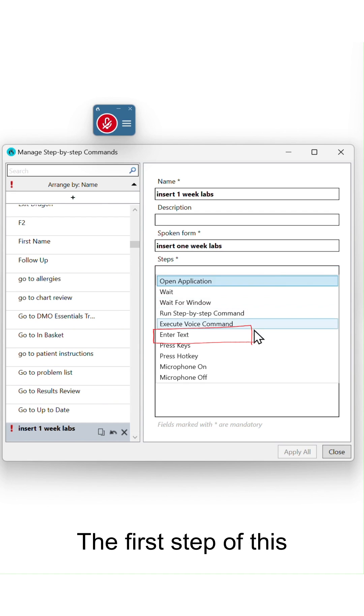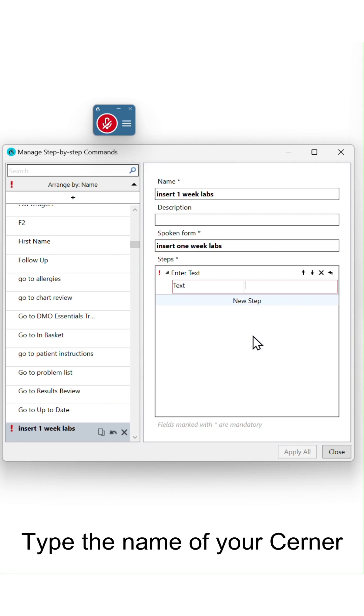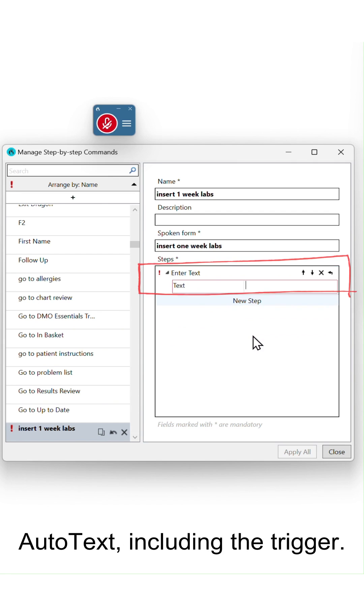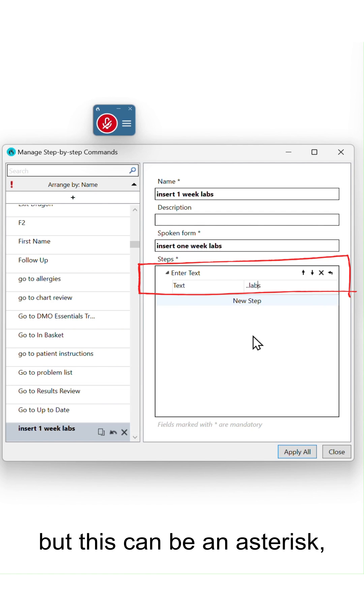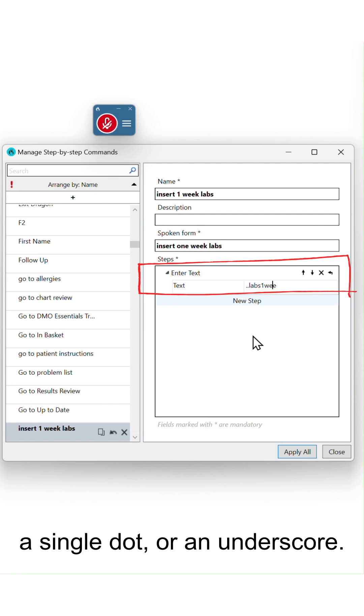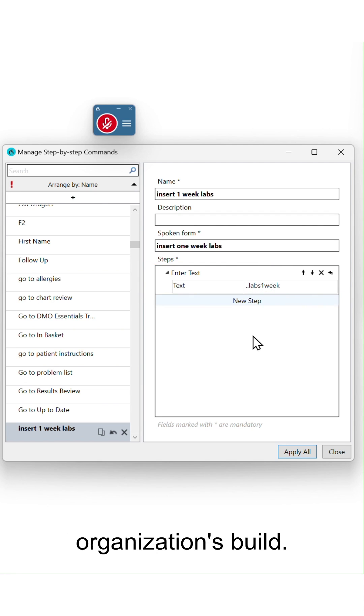The first step of this command is enter text. Type the name of your Cerner Autotext, including the trigger. At my organization, it's two dots, but this can be an asterisk, a single dot, or an underscore. It just depends on your organization's build.